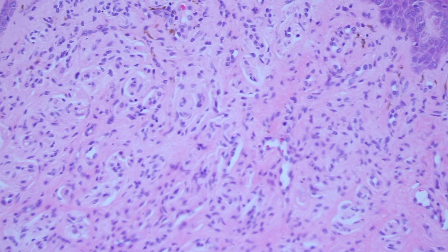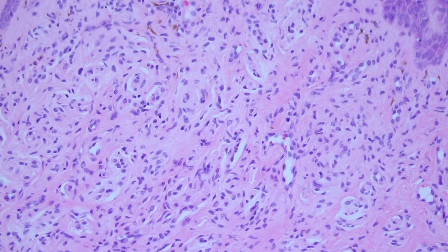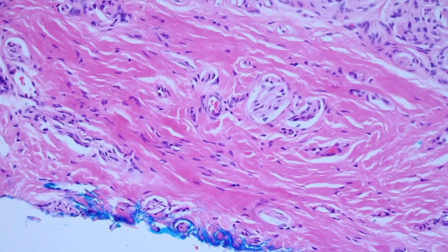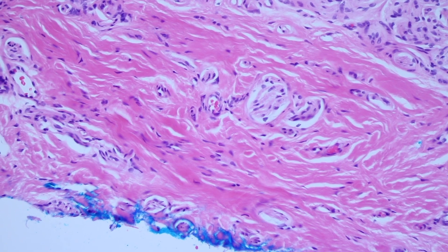The way Schwann cells are arranged — all sorts of nerve sheath tumors can have Schwann cells: neurofibromas, Schwannomas, things like that. But here you can see that these cells are actually arranging themselves into little tiny nerve bundles.